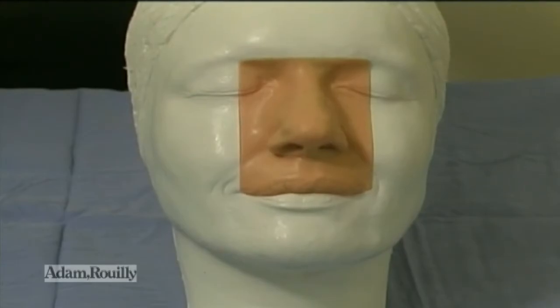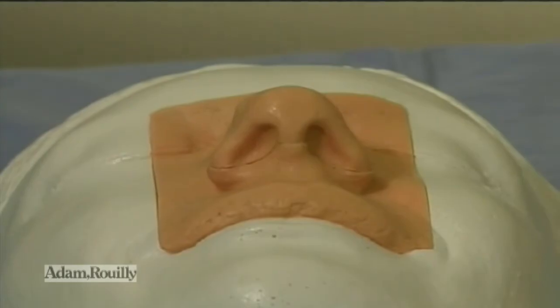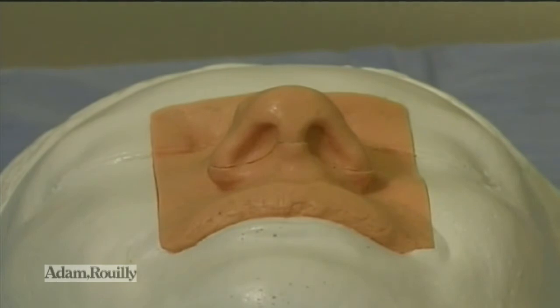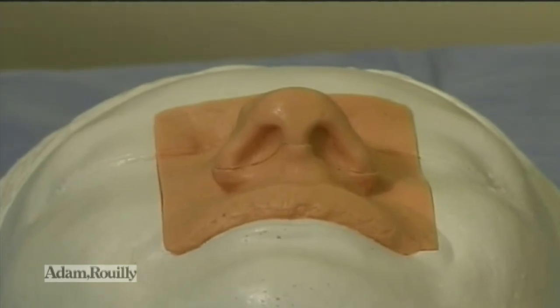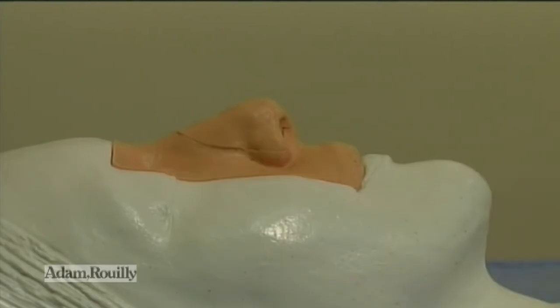The width of the alar base is satisfactory, about the same width as the intercanthal distance. The basal view of the columella and the outline of the nasal base should form an equilateral triangle. This tip is rounded and ill-defined. The nasofrontal angle lies between the upper eyelash and supratarsal fold, which is OK. The nasal dorsum is high for a woman.